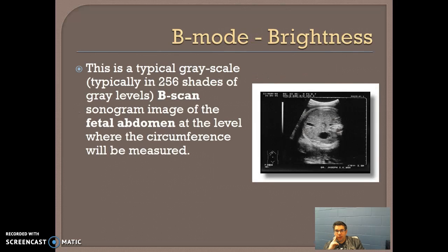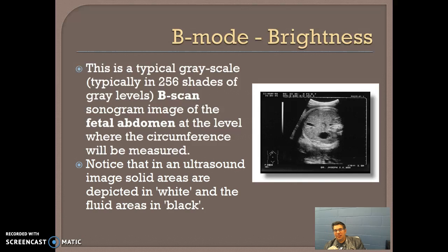All right, so here's a basic example. This is 256 Shades of Gray, which always gets a good laugh since we've had so many wonderful Shades of Gray references in the literary field. I'm sure they're wonderful. Not something I'm going to explore. Anyway, the difference in brightness is obvious here. And this is something that you're pretty familiar with from the scanning time.